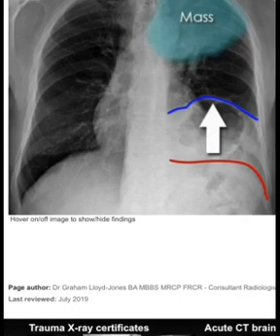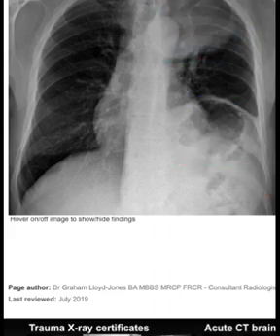Caution: occasionally a raised hemidiaphragm may be mistaken for a pleural effusion. They can have a similar appearance and both can cause dullness to percussion, but only an effusion should be drained. A CT may be necessary prior to chest drain insertion if there is any doubt.